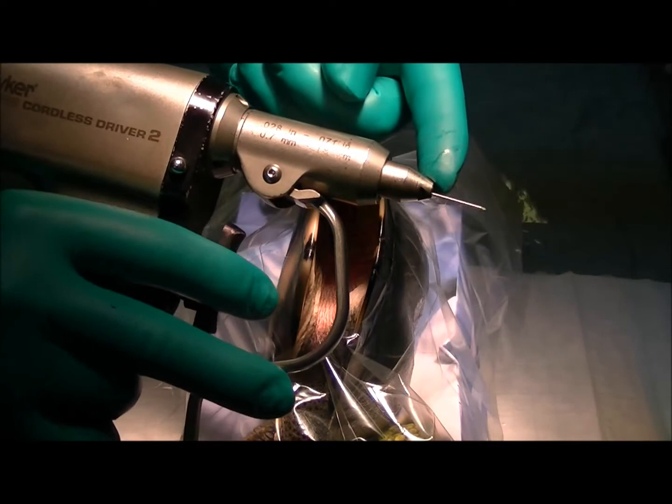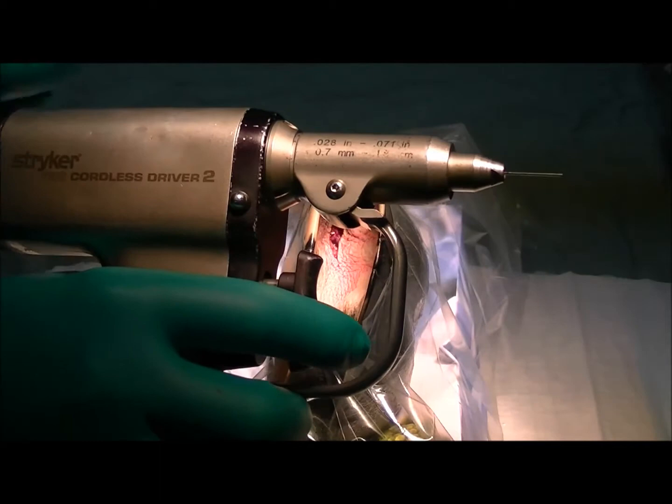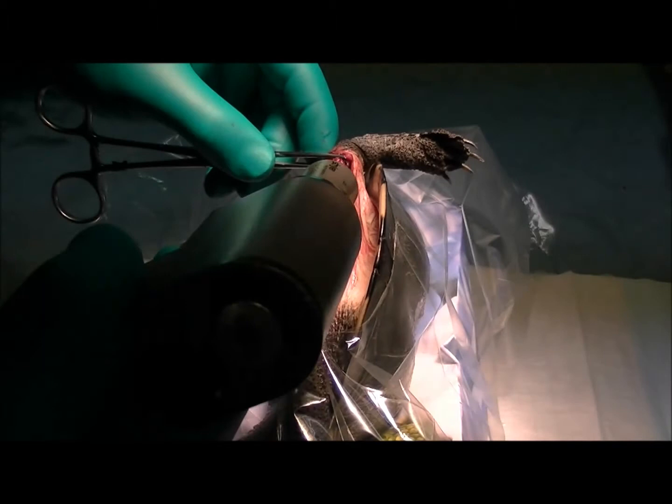We're going to use this instrument here called a Stryker drill. You can see at the point we've got a little wire coming out, and when you press the button it spins that wire. I clamp onto the actual wire as I'm pushing it through, so this allows me to accurately place it quickly and without twisting too much, so it doesn't cause too much bone damage.